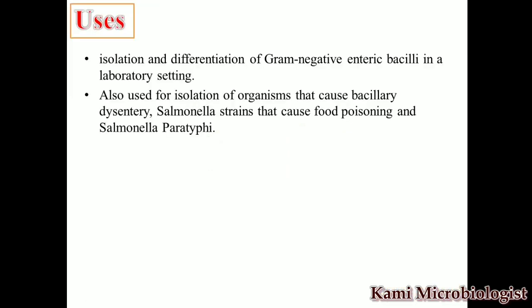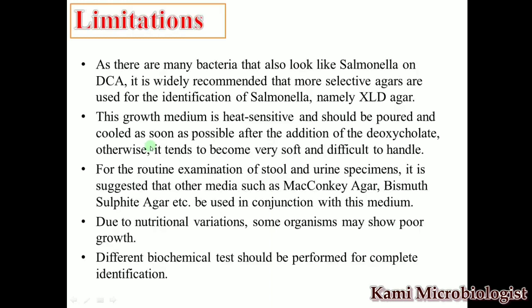Then we have the uses of this media. As we talked about earlier, we use this media for the isolation and differentiation of gram-negative enteric bacilli in the laboratory setting. Moreover, we also use this type of media in cases of dysentery, to isolate Salmonella strains that cause food poisoning and Salmonella paratyphi organisms.